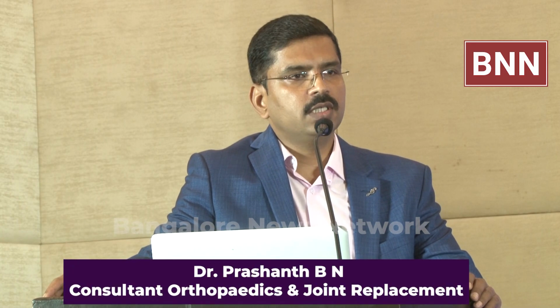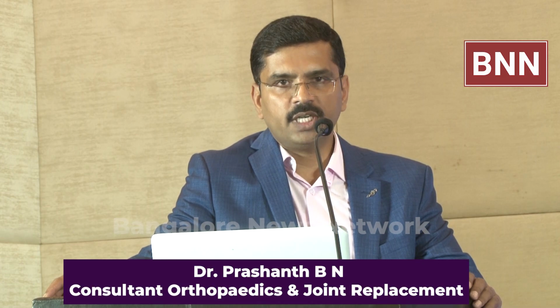Then I spoke to my colleague, Dr. Abhinandan, and a few of my friends, and I presented this case at a Madurai conference also. There they said that presently there are no implants of his size, so it has to be designed separately. After discussion with all our friends and colleagues, I tried to replan. You can see there is a little bit of overhang, which would be problematic for the patient. On the femur, one more challenging thing is that it is not a normal femur. The femur on the outer side has grown less, and on the inner side has grown more. So this becomes much more challenging.